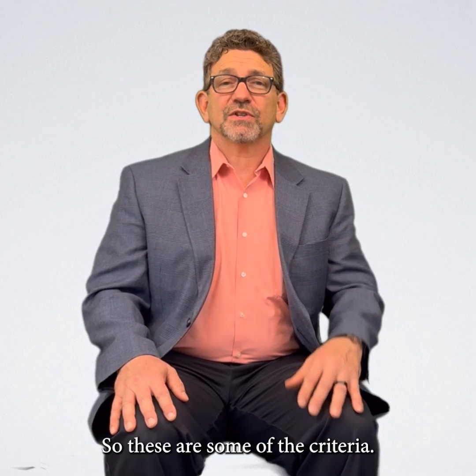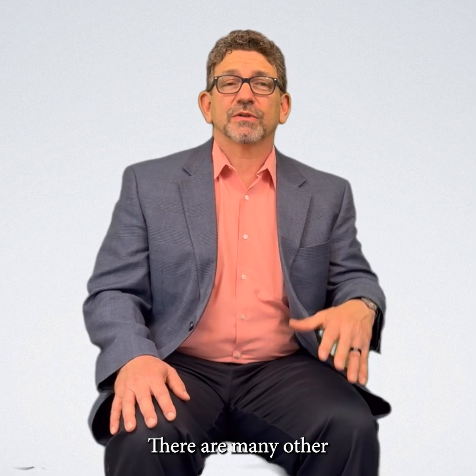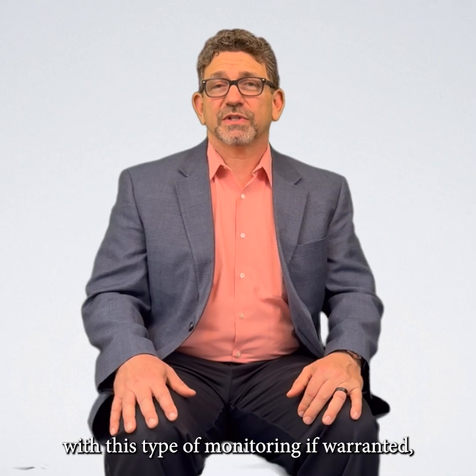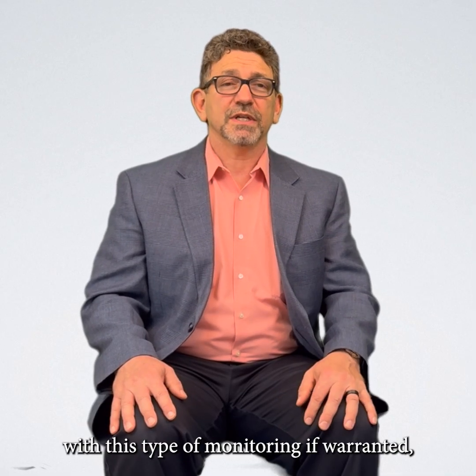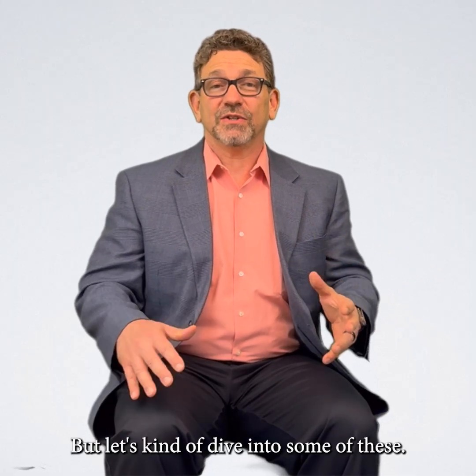So these are some of the criteria where we would measure. There are many other less common higher risk circumstances where this type of monitoring is warranted, if you're over 35, so advanced maternal age. But let's dive into some of these.